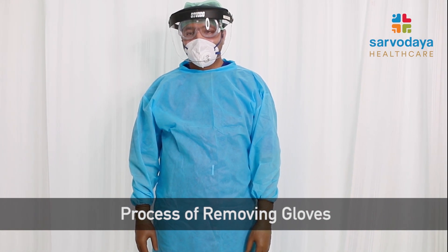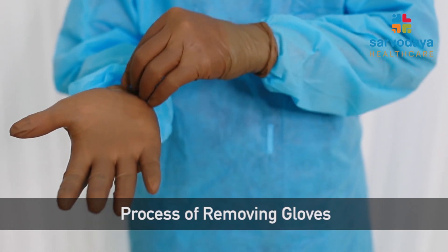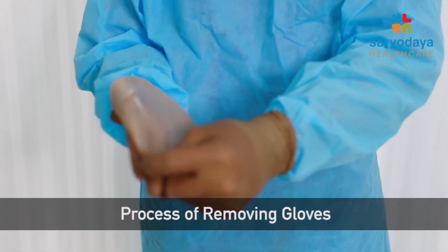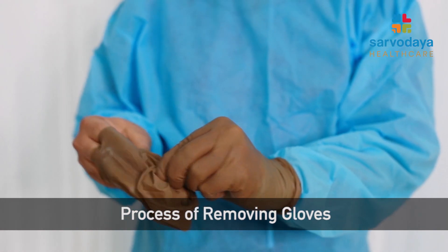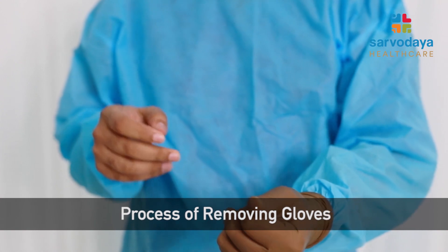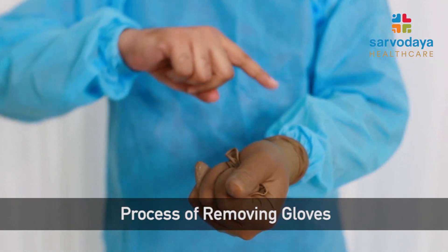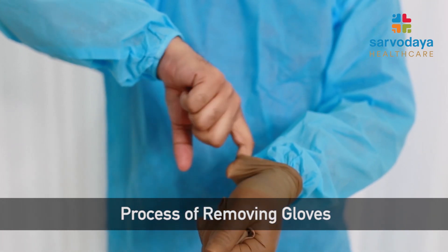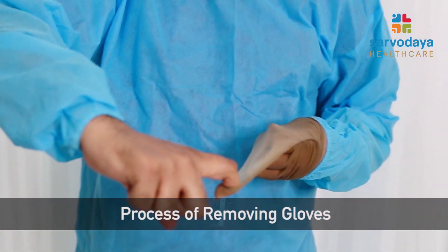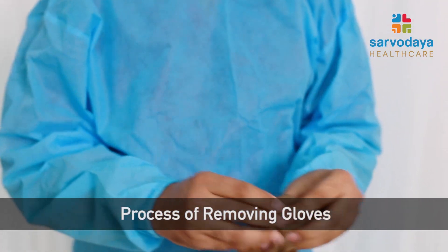Now we will first demonstrate how to remove the gloves. The first step is to pinch the cuff of one sleeve and deglove it or peel it off. While peeling it off, try to make it into a small ball and put it in the other gloved hand. With the help of the index finger of the degloved hand, put it underneath the cuff of the other glove and peel it off. Then put it in the bin.